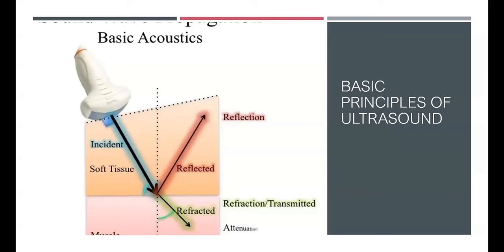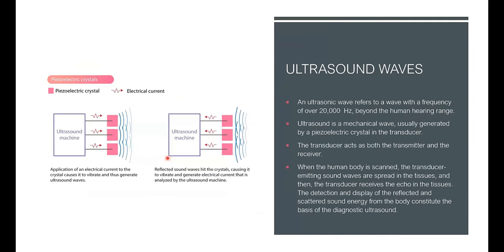Now, a very simple approach in lung ultrasound is first having a little bit of an idea about what lung ultrasound actually is, but before that, how ultrasound is actually used. Whenever we use an ultrasound probe, what we're basically looking to do is deliver ultrasound waves. And these waves will interact with the surface of the area that you're scanning, and then the tissue beneath it, and then deeper tissue. And clearly what we are then looking at is an image generated by the waves that are reflected back. So reflection is the foremost mechanism of giving us images when we perform ultrasound.